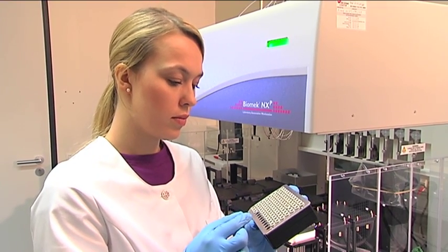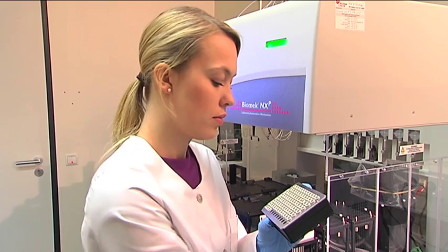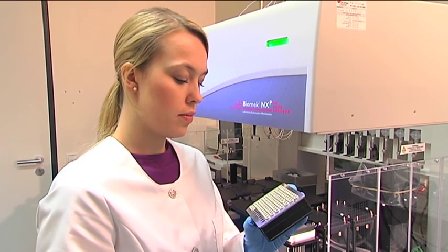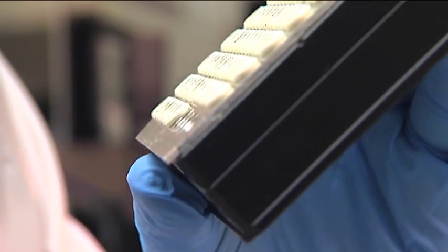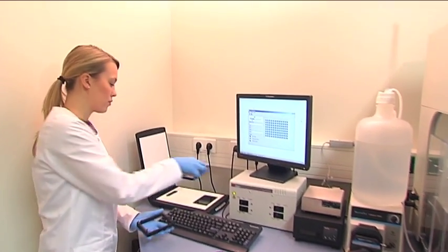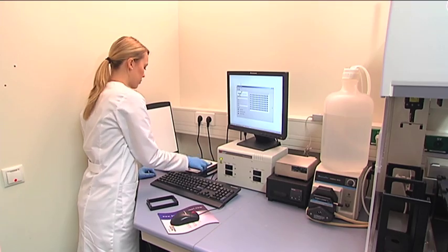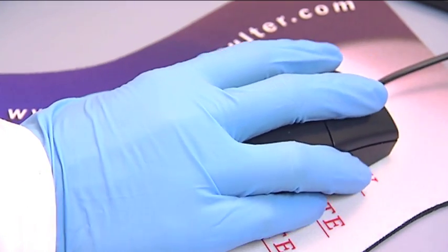The ear tissue samples are checked in the laboratory and sorted into sample racks. The individual samples are then identified by special software and the sample racks are marked with a barcode.